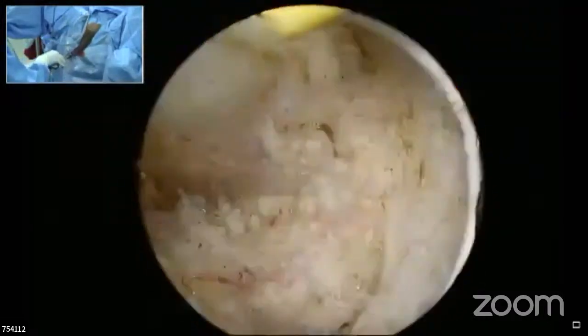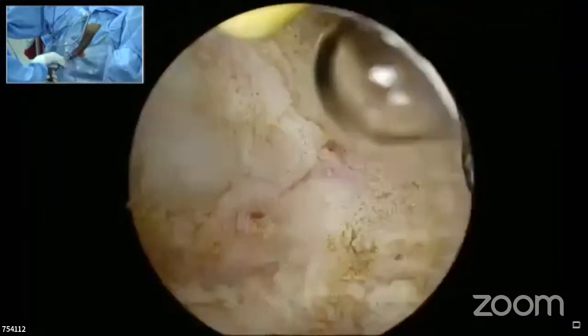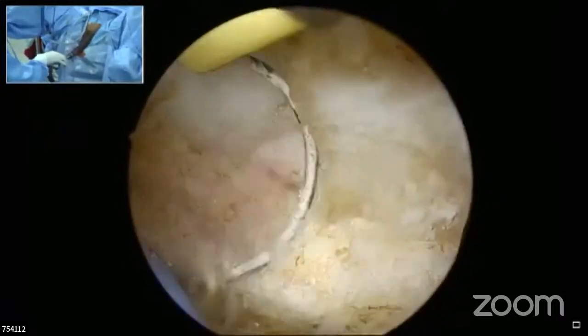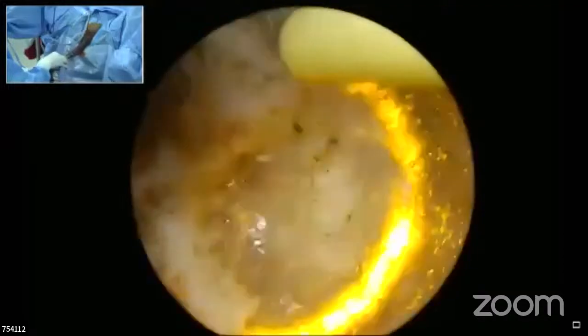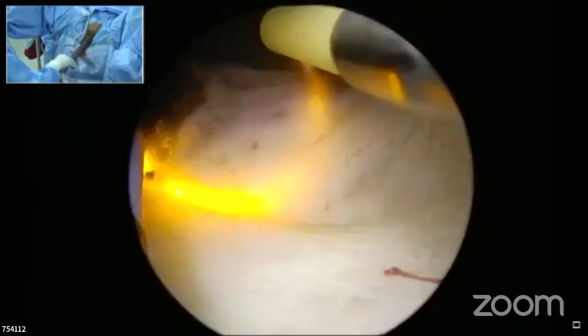See, the branching of the artery also takes place. There is no doubt. Yes, when they go laterally along with the capsule, near the capsule also they may come out. So that is all right. But as long as you are seeing an arterial bleeder, you have to fulgurate it. There is no doubt.